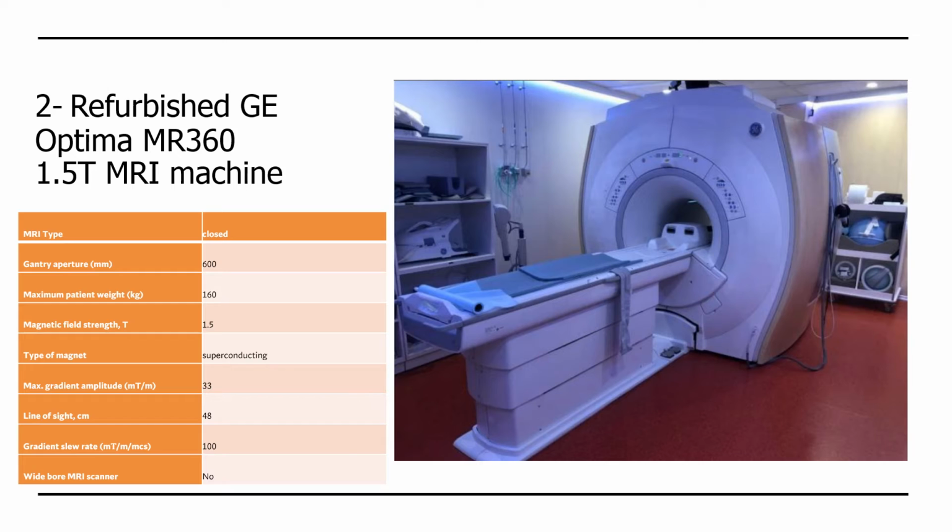For the second device we select the refurbished GE Optima MR360 1.5 Tesla MRI.